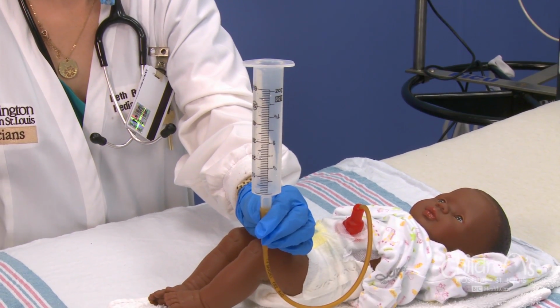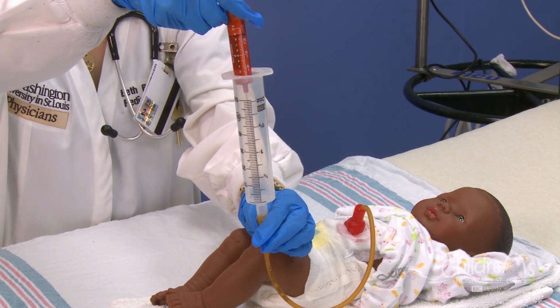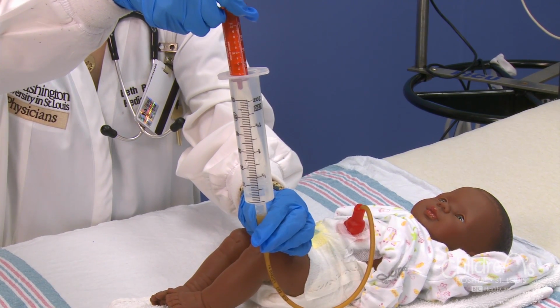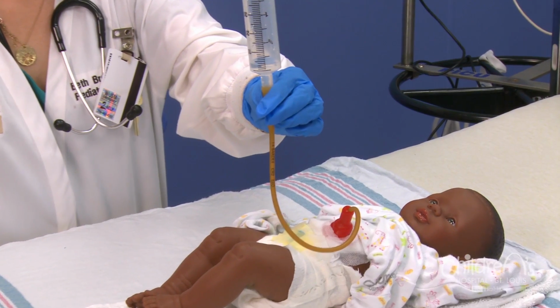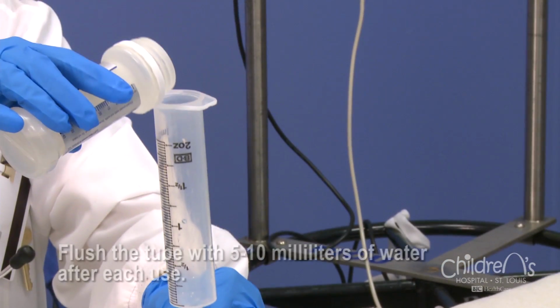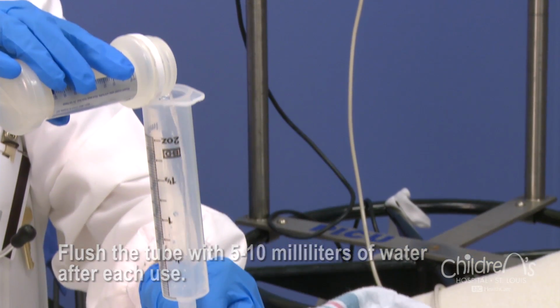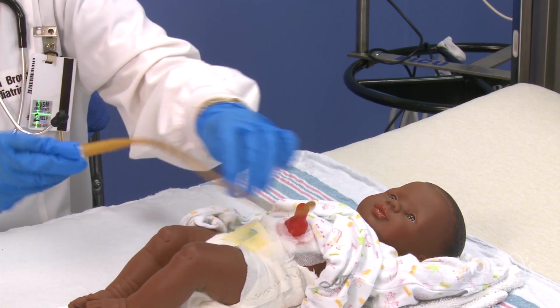Open and unclamp the gastrostomy tube if there is one present. Put the medicine into the feeding syringe and allow it to flow into the tubing, as you would if feeding by gravity. Put 5 to 10 milliliters of water into the feeding syringe and flush the tubing. Clamp or close the tubing and replace the cap or rubber band.